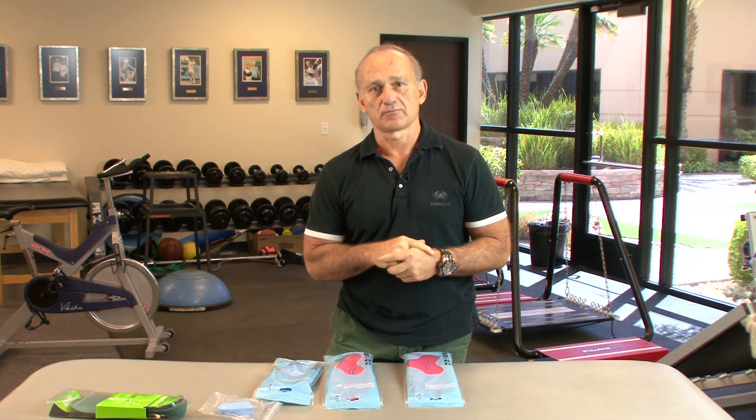That is the main reason why I use these products. For every 10 people that come in the office with an overpronation problem, I might have 1 come in with an oversupination problem. So those have been mostly described as why the person's having pain.